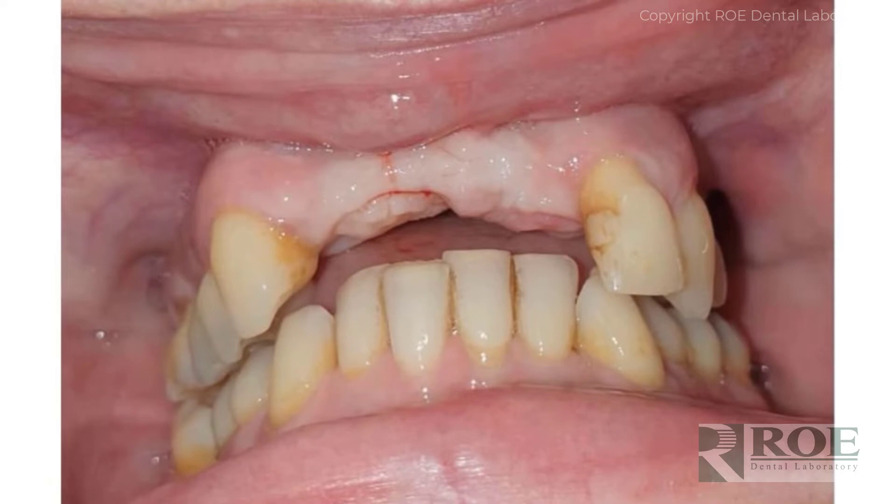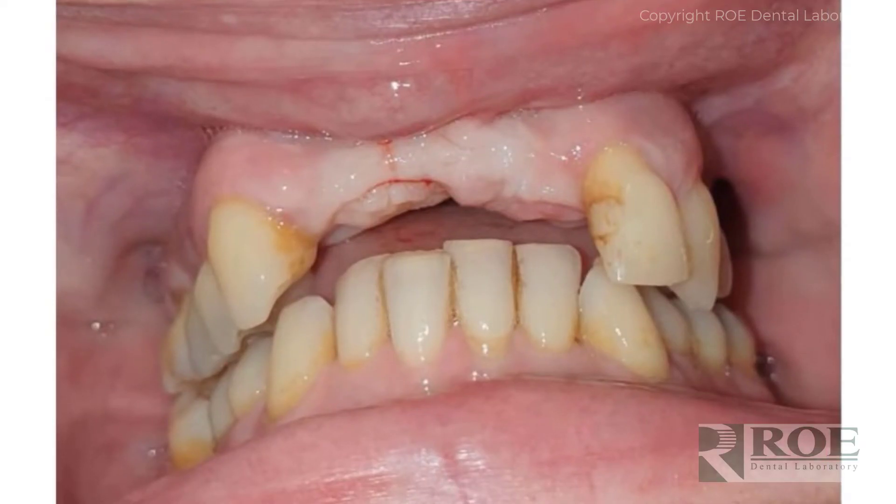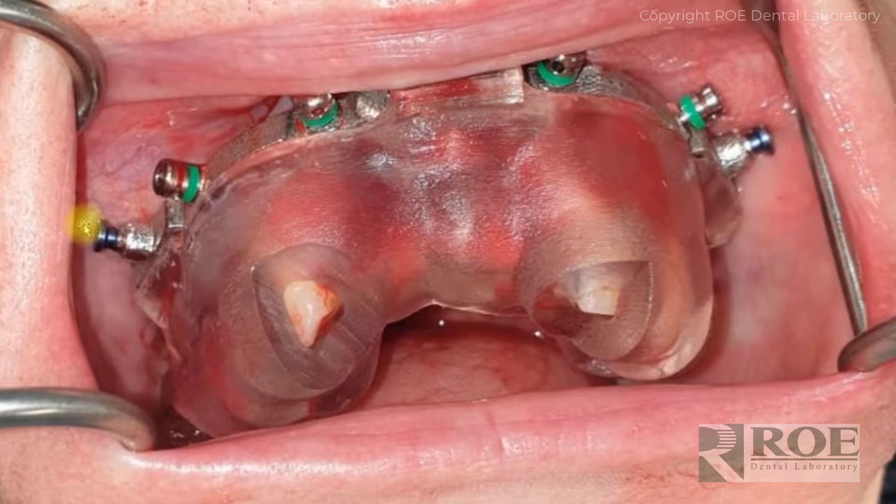For the Chrome Natural surgery, let's go through the surgical process. The first step is to anesthetize the patient, then seat the pin guide to make sure it fits, then remove it. A labial flap is laid — just labial — with a crestal incision in this case. The flap is laid forward, then the pin guide goes back in with the fixation base. The green pins correspond with our green step-down drills. All Chrome drills are now step-down: two millimeter diameter but with a 1.8mm tip at four millimeters.